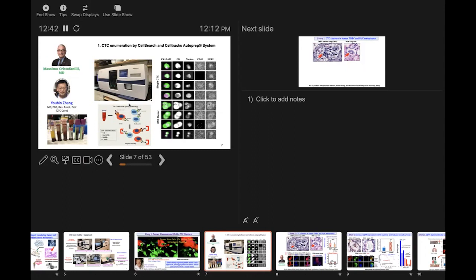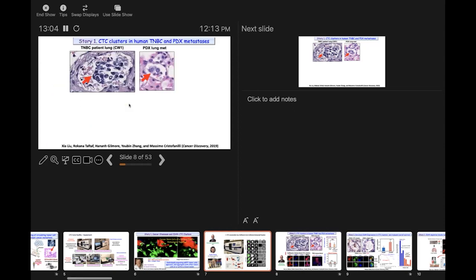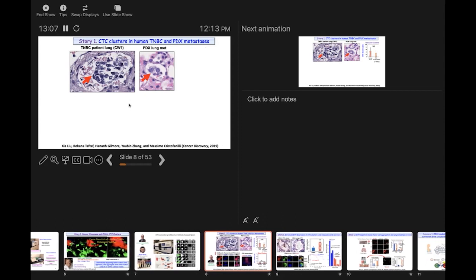Now the clusters definitely exist in human blood, and this can be shown by multiple approaches. CellSearch is just one of the instruments or methods we use. We have also used other approaches to complement the blood processing, in case there are any artificial effects. For example, we use IHC staining from human patients. If you have never seen CTCs or you don't believe, you'll see them in tissue sections in the vasculature structure. Here you can see a cluster of tumor cells loosely attached to each other.